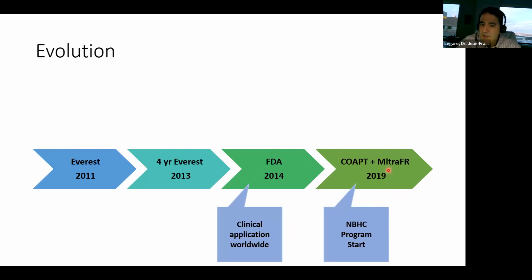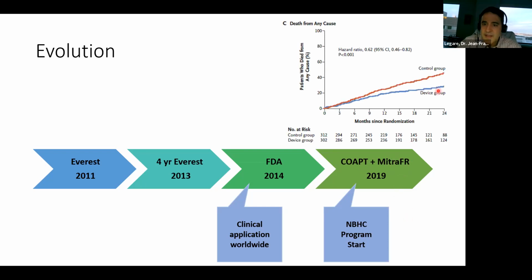The biggest difference between the 2 was how rigorous the medical therapy and how big the ventricle and the severity of MR for entry criteria were, essentially showing a pretty significant improvement in survival and event-free survival in the device group versus a control group. And this is for the COAPT study, which really led for people, and certainly in the secondary MR world, in patients on optimal medical therapy, in which you still have functional class 2 symptoms or more, to be considered for mitral clip, assuming they're suitable candidates.